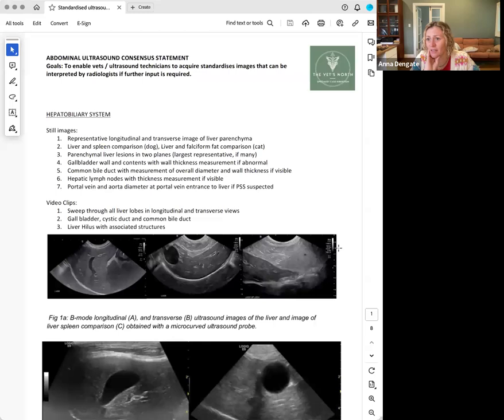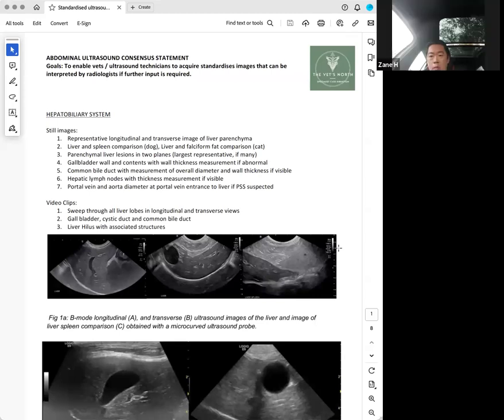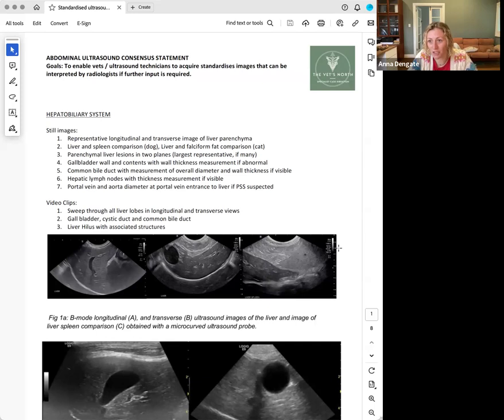in at 10 years of age. What ultrasound finding or clinical finding would make you go, oh, I should really check for a shunt in this patient? Big kidneys and stones at a young age. Stones, really good, yeah. It's a really luxurious position when the stones have already been discovered, already been analysed, come back as urate, and then you're asked to do a scan. But actually what happens most of the time is they're coming with urinary symptoms and you see uroliths.